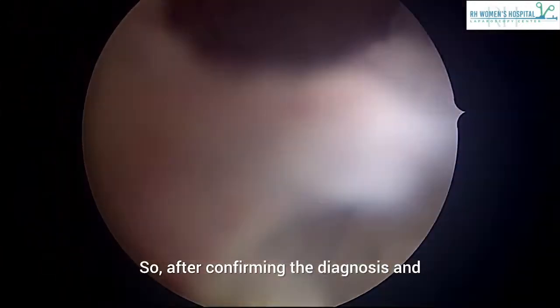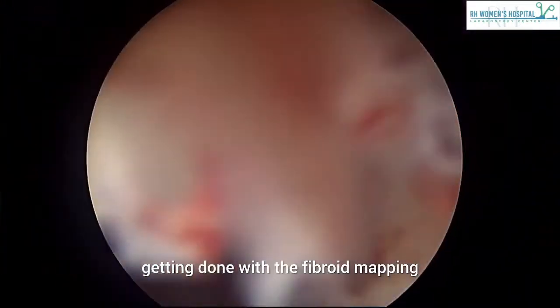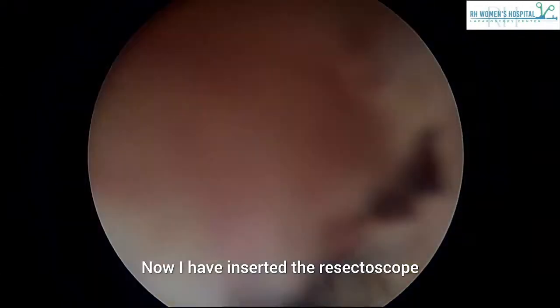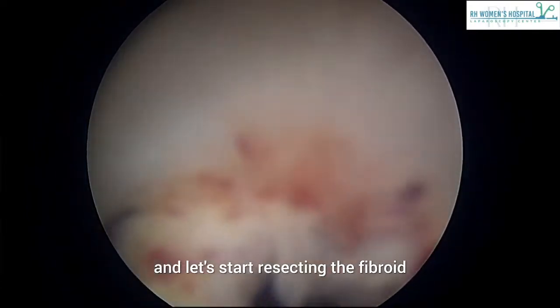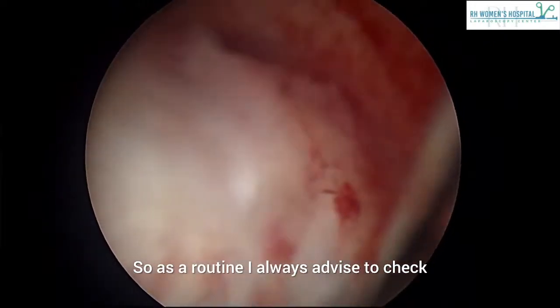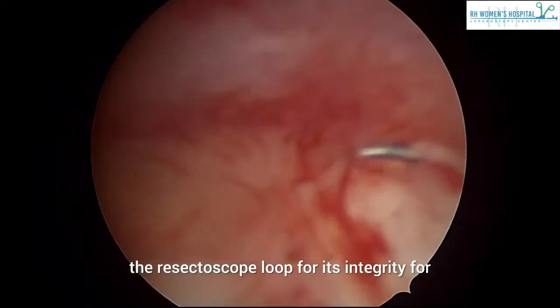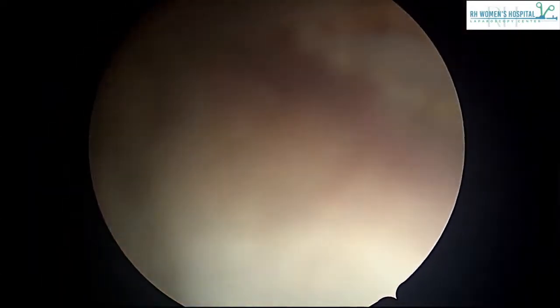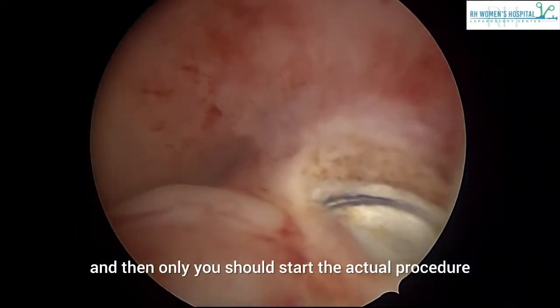So after confirming the diagnosis and getting done with the fibroid mapping, now I have inserted the resectoscope and let's start resecting the fibroid. So as a routine, I always advise to check the resectoscope loop for its integrity, for the active power cautery supply, and then only you should start the actual procedure.